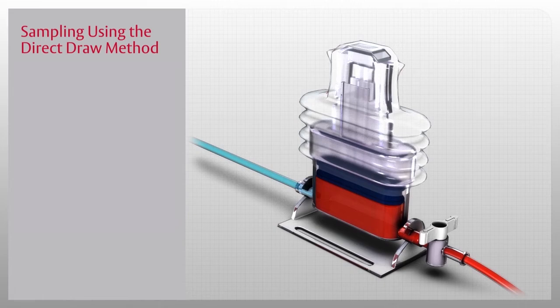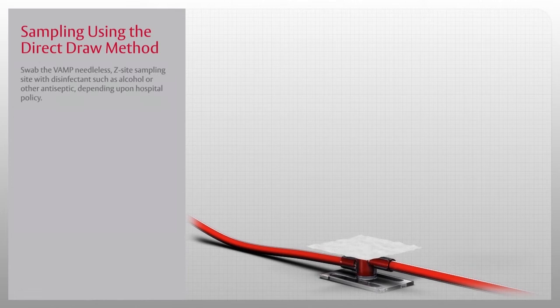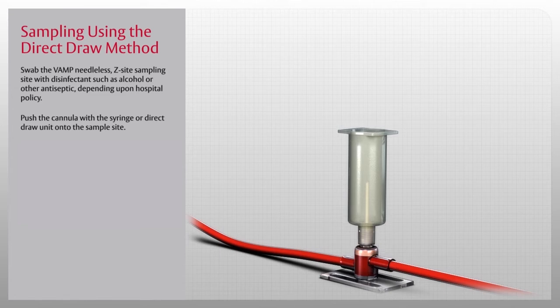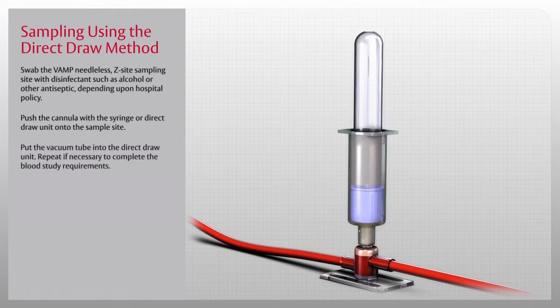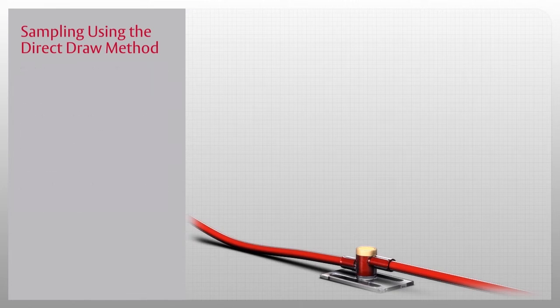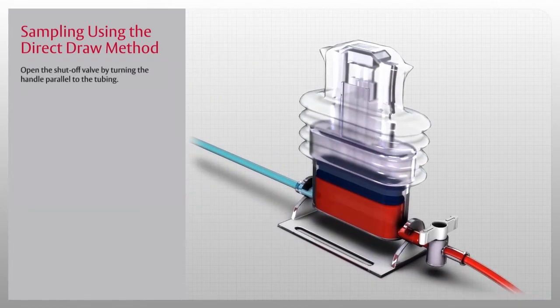You are now ready to draw the blood sample. Swab the VAMP needleless Z-site sampling site with disinfectant such as alcohol or other antiseptic depending upon hospital policy. Then push the cannula with the syringe or direct draw unit onto the sample site—do not use a hypodermic needle through the sampling site. Put the vacuum tube into the direct draw unit and repeat if necessary to complete the blood study requirements. After the last sample has been drawn, grasp the VAMP direct draw unit by the cannula and pull it straight out.